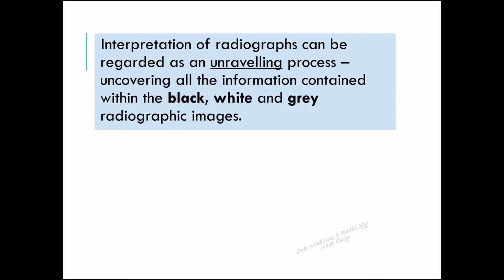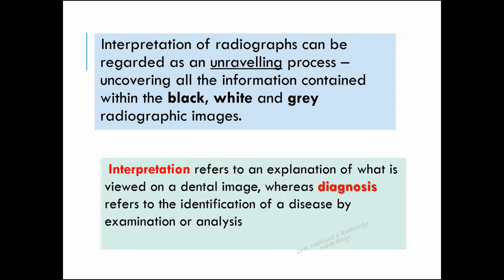Interpretation of radiographs can be regarded as an unraveling process, that is, uncovering all the information contained within the black, white and grey radiographic images. Is interpretation and diagnosis the same? No. Interpretation refers to an explanation of what is viewed on a dental image, whereas diagnosis refers to the identification of a disease by examination or analysis. So, interpretation is what we see on a radiograph and diagnosis is identification of a disease by interpreting the radiograph.